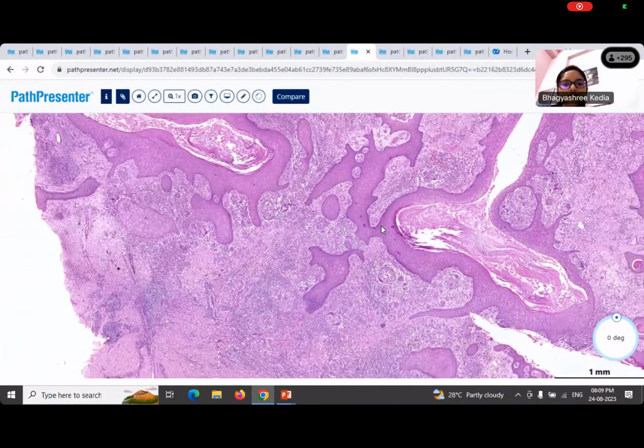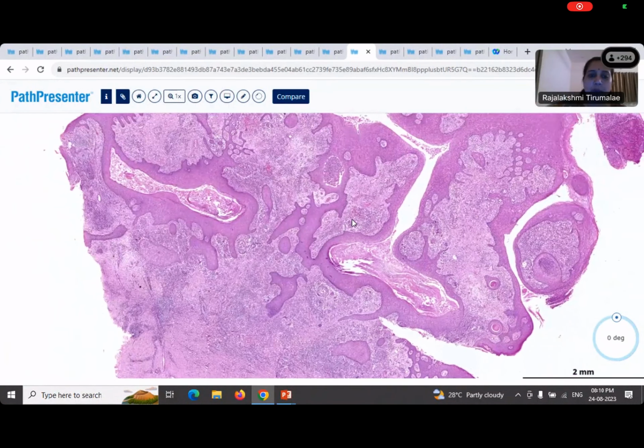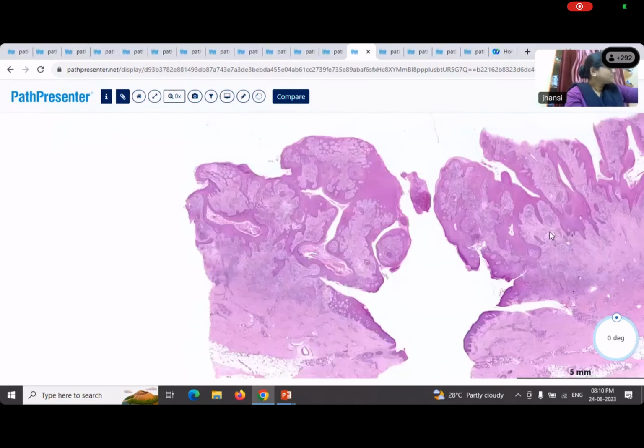Now, suppose you did not see these fungi, right? You had a similar pattern, these granulomas which were tuberculoid or epithelioid granulomas, and like you rightly said, with this kind of hyperplasia, is there any other disease that you would like to think of? Sometimes can mistake for squamous cell carcinoma. Any other condition which is quite common in our country? Leprosy, ma'am. Leprosy, no. You will not find this degree of hyperplasia in leprosy.